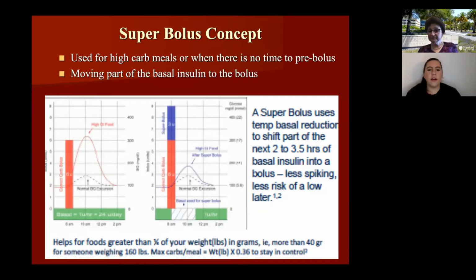So just to clarify, when you look at the total daily dose on your downloads, it should be approximately equal percents of basal and bolus insulin. Right, yeah. Okay. And usually it's the other way around. Usually when we look, basal would be 70% or 80%, and then the bolus amount is small.